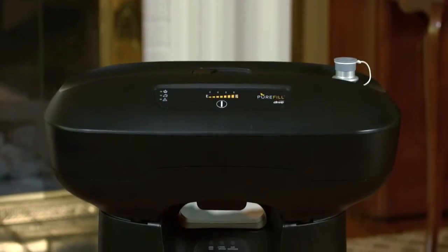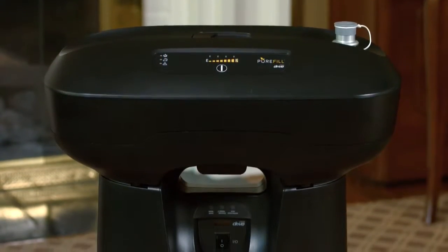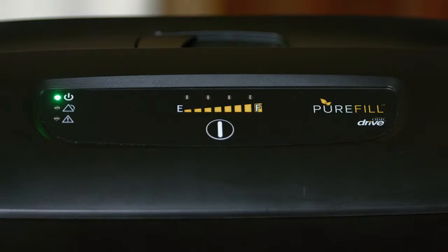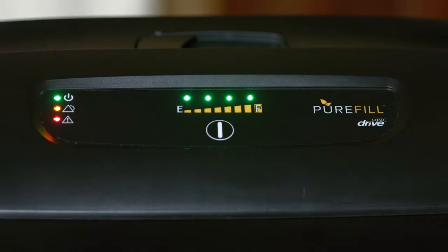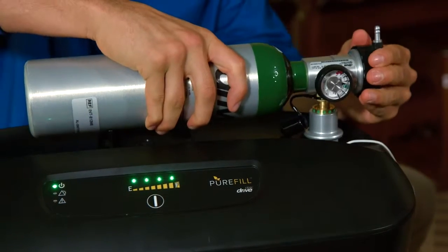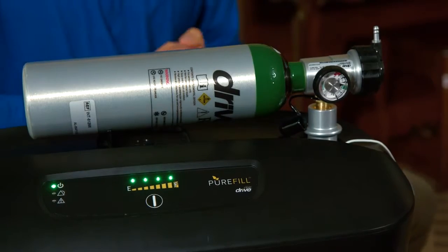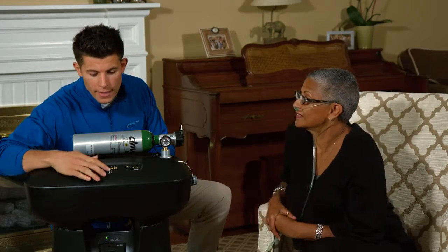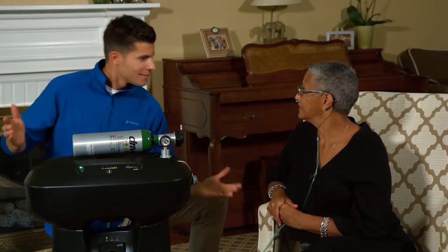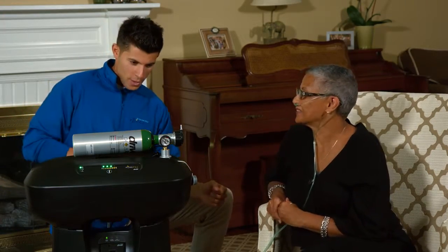The PureFill has a compact design and a simple user interface, which includes a power button, a clearly visible fill button, LED fill status and indicator lights, and a simple cradle and port for your oxygen cylinders. You may continue to breathe from your concentrator while the PureFill is in operation, at a prescribed flow setting of 3 liters per minute or less.